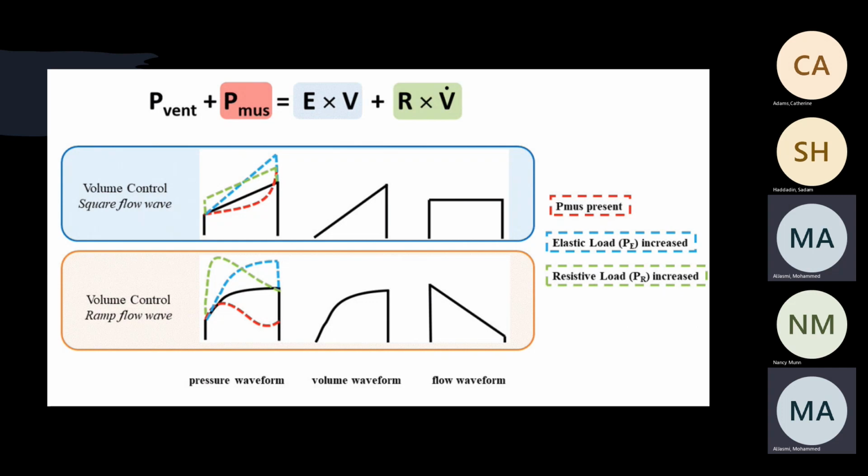The patient needs less sedation, not more sedation. If it did not stay the same, it's just the timing of when the machine is giving and the patient is giving. That's why nowadays we don't call it reverse triggering, just early triggering. By decreasing the rate, you give more time to exhale, and then look at the patient's mechanics and see how he does.